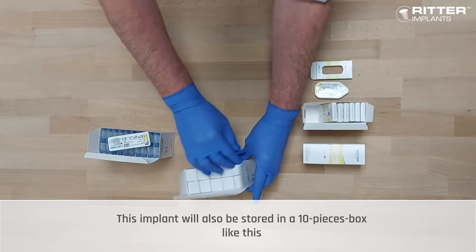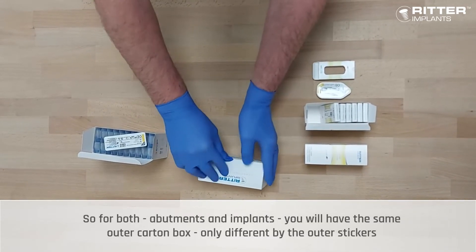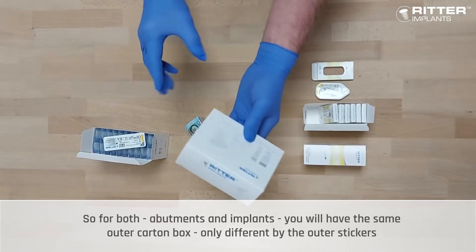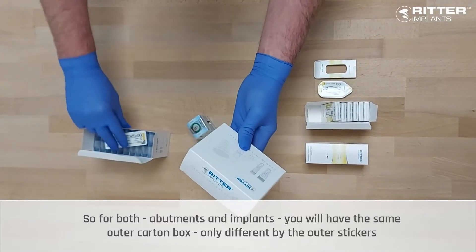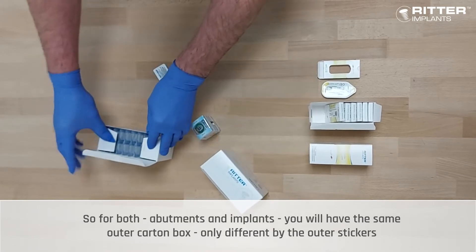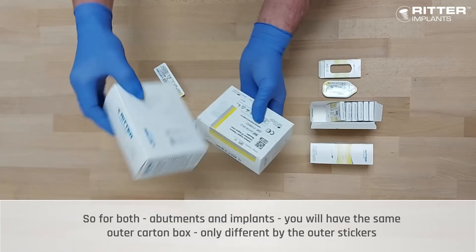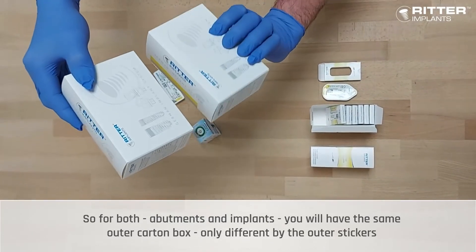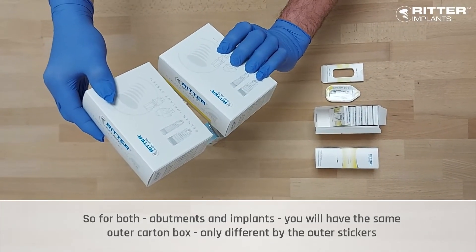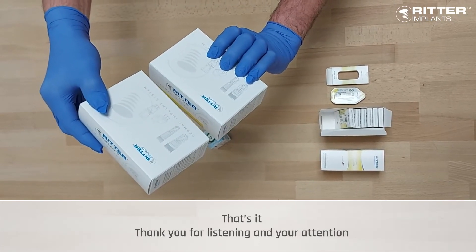This implant will also be stored in a 10-piece box like this. For both types — abutments and implants — you will have the same outer carton box, just differentiated by the outer stickers. That's it. Thank you for listening and your attention.